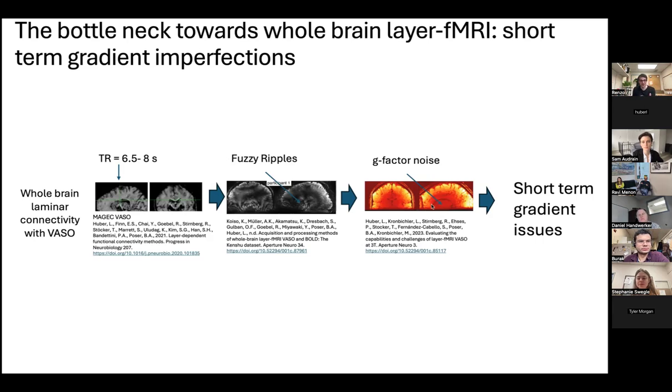And when you look at all these struggles, it all comes down to GRAPPA. Because if we were able to do more GRAPPA, then we would have shorter TRs, right? We could skip more k-space lines. But as soon as you overdo GRAPPA, you have these artifacts. So if we did better GRAPPA, then we wouldn't have these artifacts and might be able to push GRAPPA a bit further. But GRAPPA also has these noise amplifications, the G factors. So we spent some time trying to figure out the limits of GRAPPA, and GRAPPA is also not something that I'm a particular expert on.